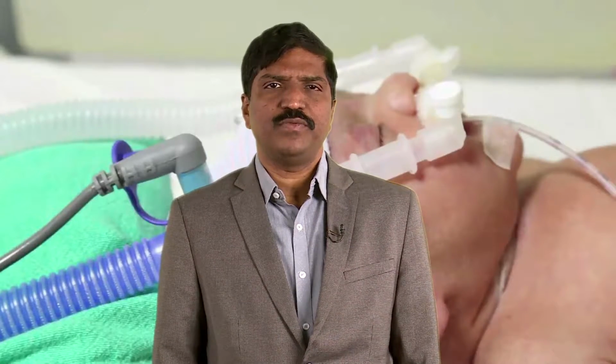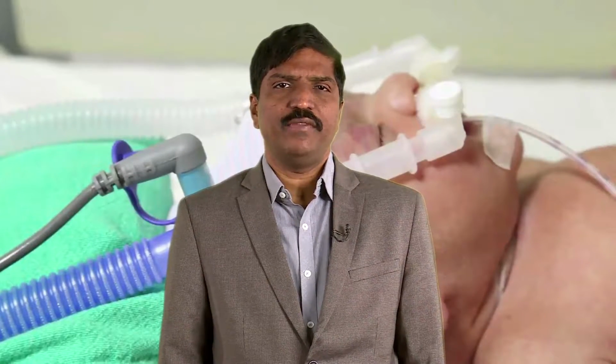Assessment is ongoing, systematic, thorough and meticulous. Vitals need to be assessed every 2 to 3 hours, and complete assessment of infant, interface and CPAP system should be done every shift or every 4 to 6 hours. Infant monitoring should include vitals, assessment of all the organ systems. Also, one needs to assess the adequacy of FiO2, CPAP and flow in each shift.